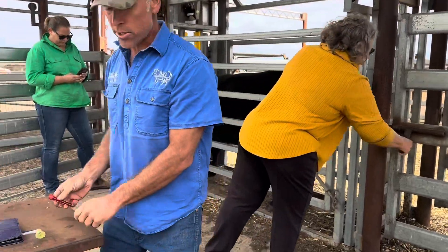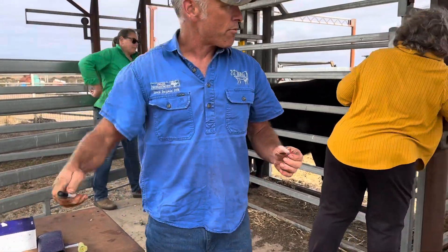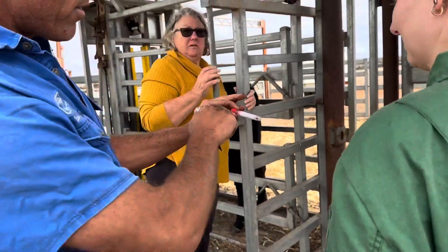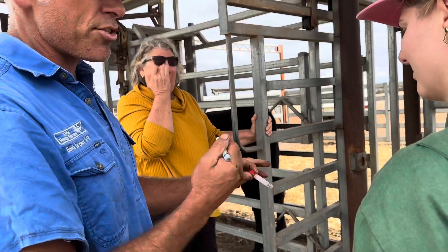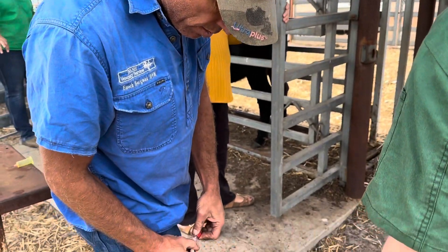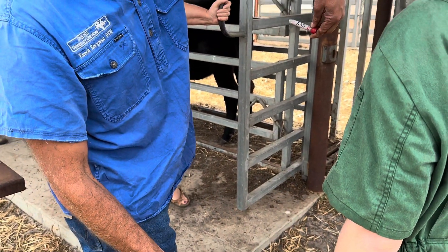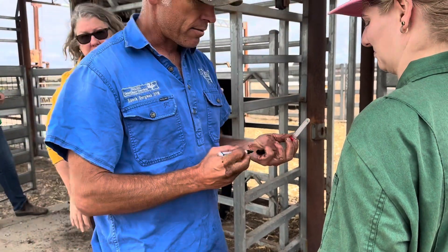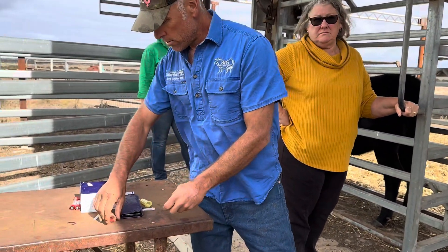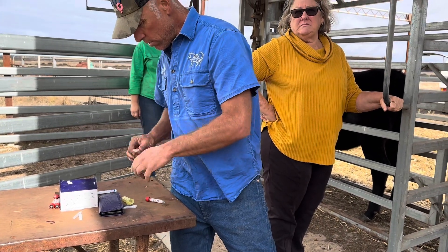Alright, so here's your turn. What's this number? 44. So S44 is yours. Always hold the cap in your left hand — unless you're left-handed — but always do it consistently so that at the lab they know which way to read it. It's not hieroglyphics — you don't want it to look like 69 or 96, whatever. I'll get you a fresh hub for you.